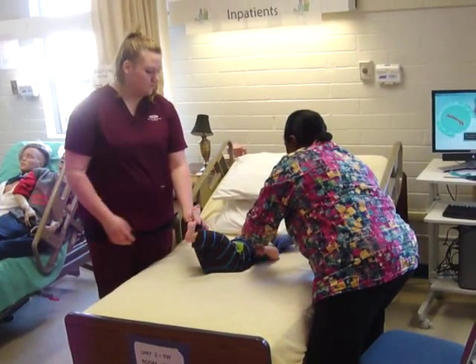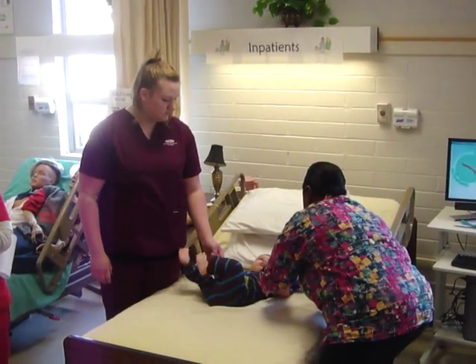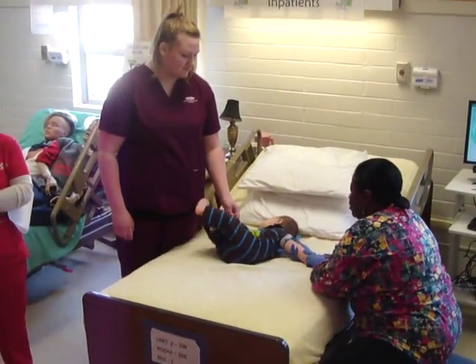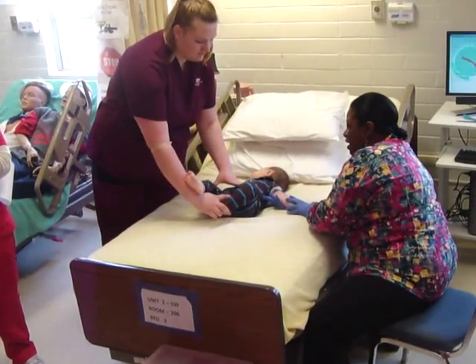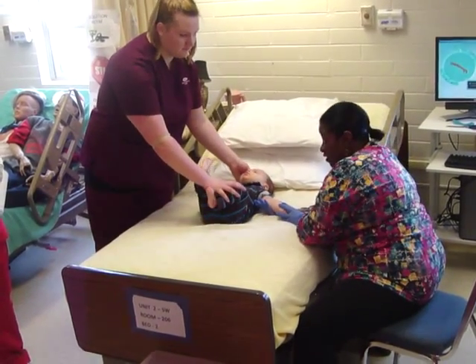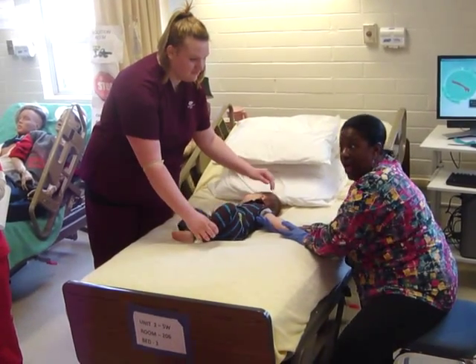I've cut the tourniquet in half and we're going to try to tie the tourniquet on and see if we can feel a vein on him. See how you have to hold his arm just like that — and usually see how they twist? So basically this is just one phlebotomist holding, and that's the mom or another phlebotomist doing that. Now I need somebody to feel and find and draw the blood.